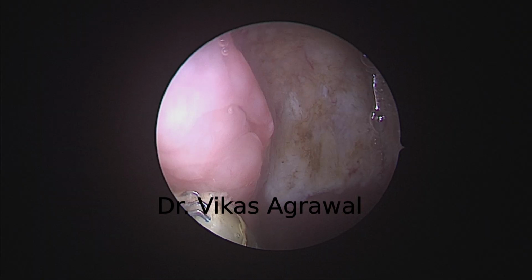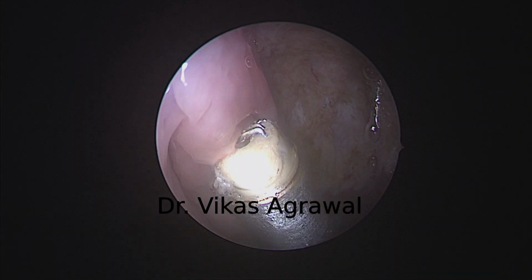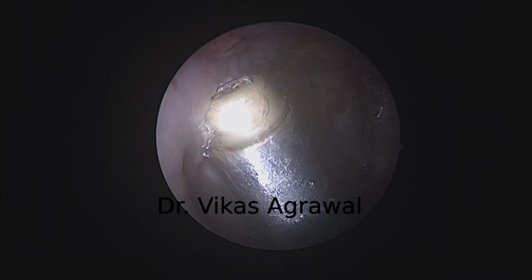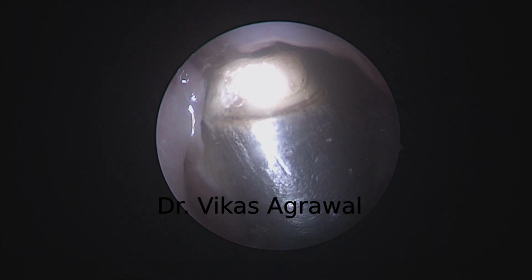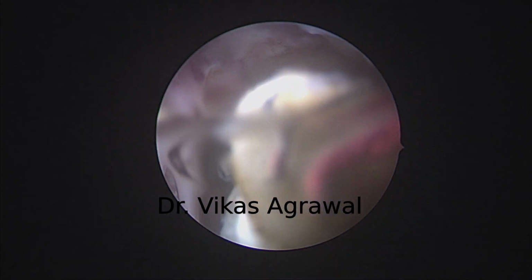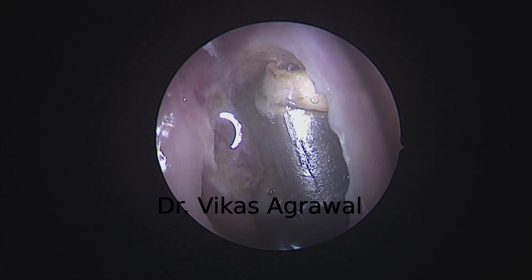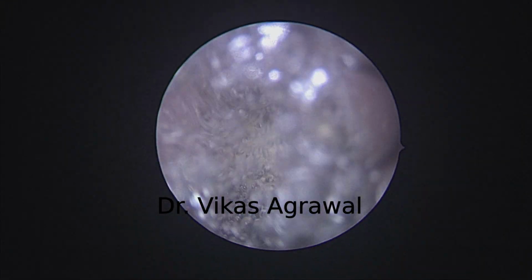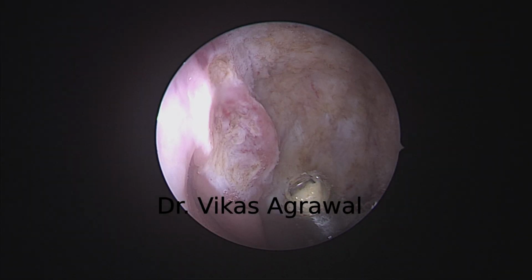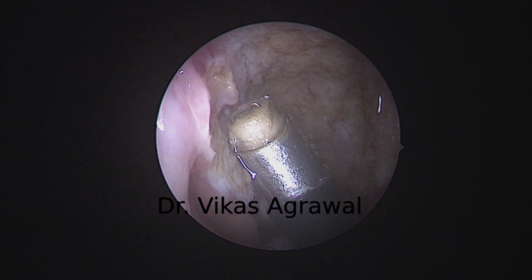That's the torus tubarius, that's the eustachian tube, right? So I will take care of this lateral boundary, the torus tubarius, very superficially. Can you pour some saline? So the superior boundary of the adenoid on the right side. Thank you. That's the torus tubarius. You can see how much of adenoid was still there on the torus.